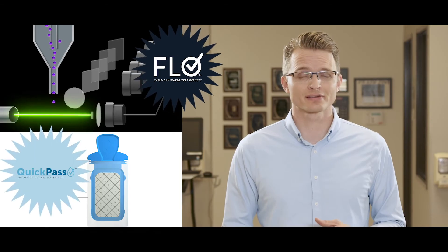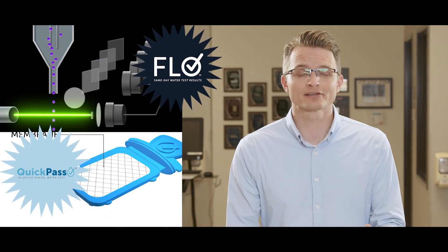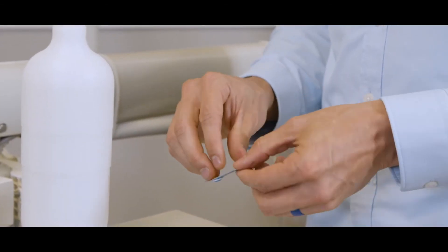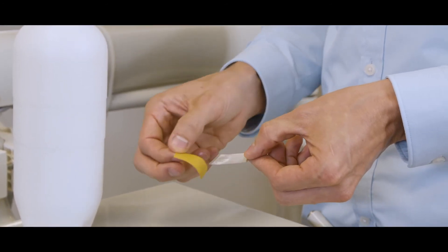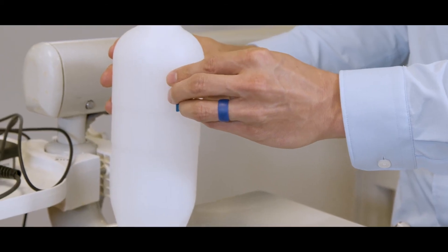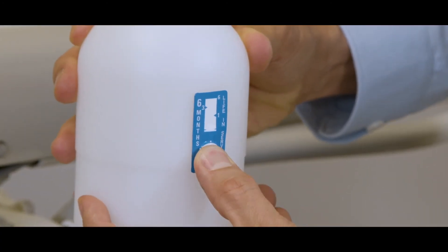Replacing your blue tube at proper intervals is one of the most important parts of making sure you pass waterline compliance testing — after all, that's why you've chosen blue tube, because it's backed by science and proven in practice to be effective. Here's how this little guy works: once you've installed your blue tube, remove the adhesive tape from your six-month replacement indicator and stick it on your dental unit water bottle or maintenance calendar. Activate it by pressing the power button.